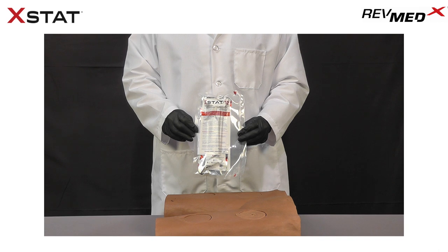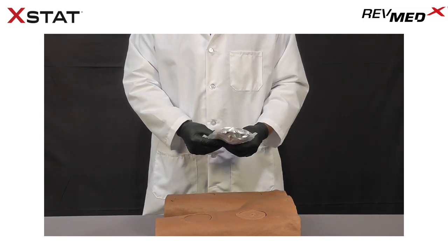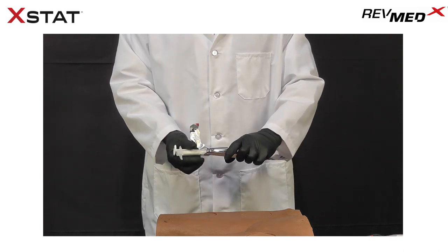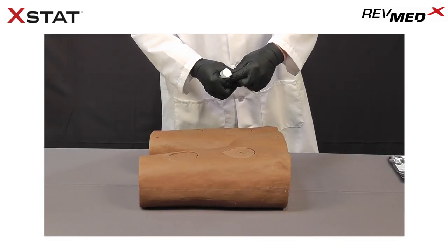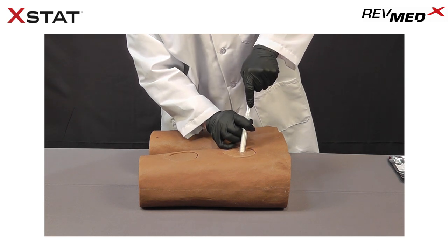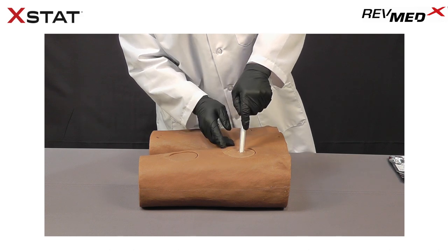Read indications for use and warnings and cautions on the front label and back label. Open outer pouch and remove inner package. Open one inner package and remove applicator and plunger. Insert applicator into wound track as close to the bleeding source as possible. Insert plunger into applicator and push plunger firmly to deploy sponges into wound. Material should flow freely into the wound. Deploy Extat within 30 seconds of insertion into wound.